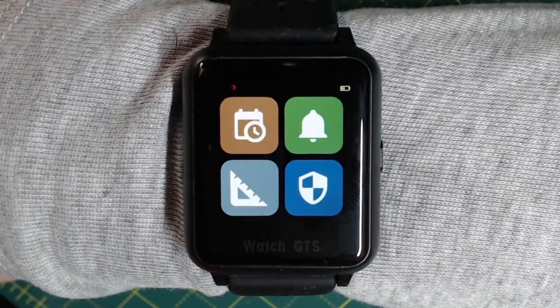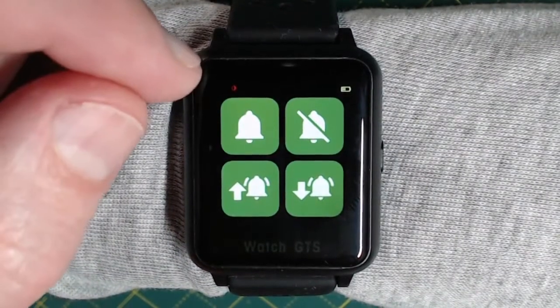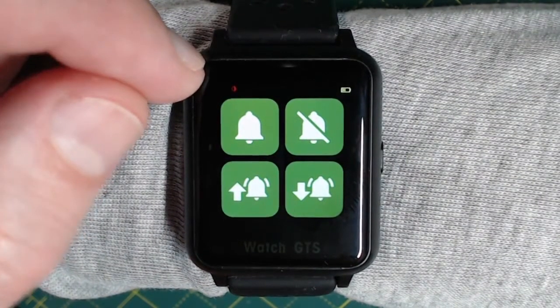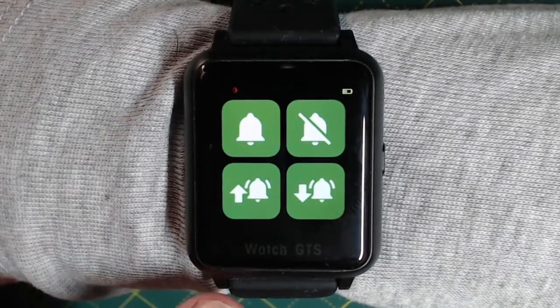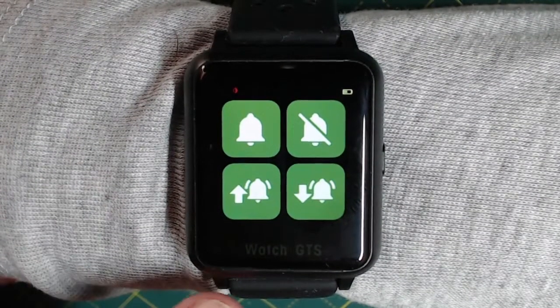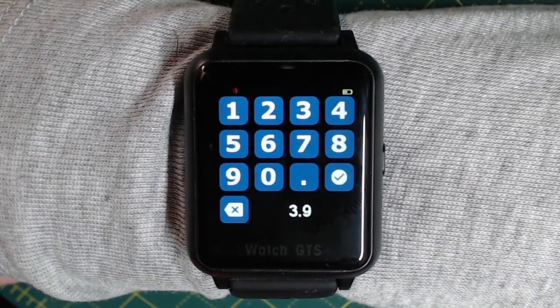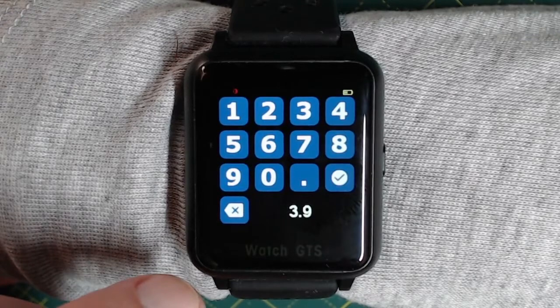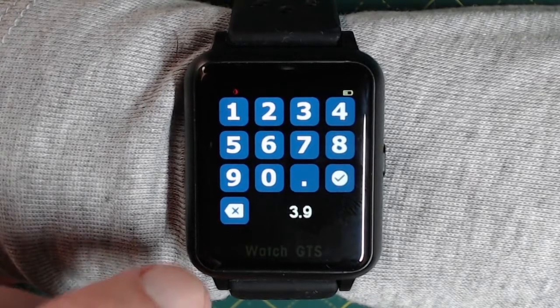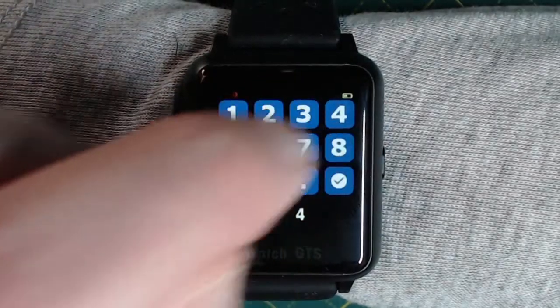Let's go into settings and then let's go into alarms. Here you've got four options: alarms on, alarms off, set the upper limit threshold, and set the lower limit. Let's go ahead and set the lower limit. It's currently set to 3.9, which is a measurement in mmol. If you're using milligrams per deciliter, then the units would probably be different. So I key in 4.0 and hit the tick when done.